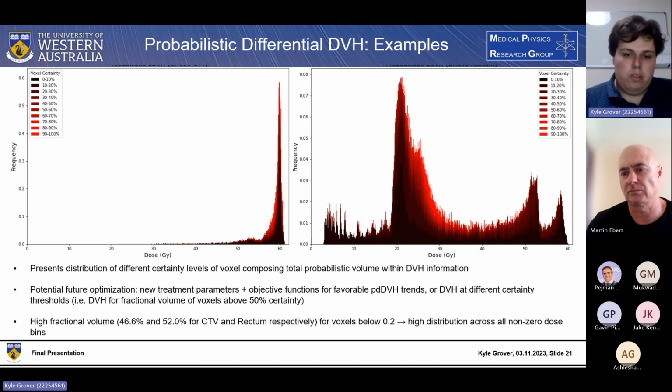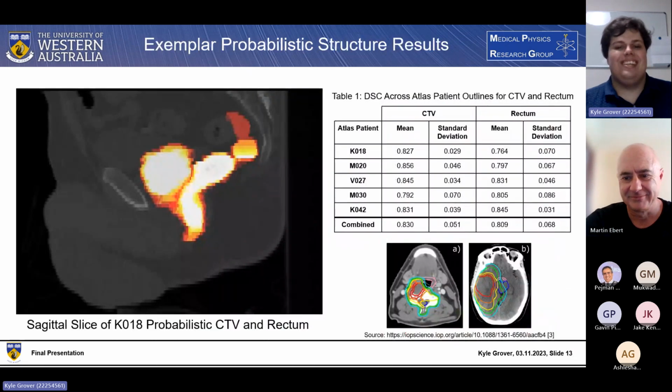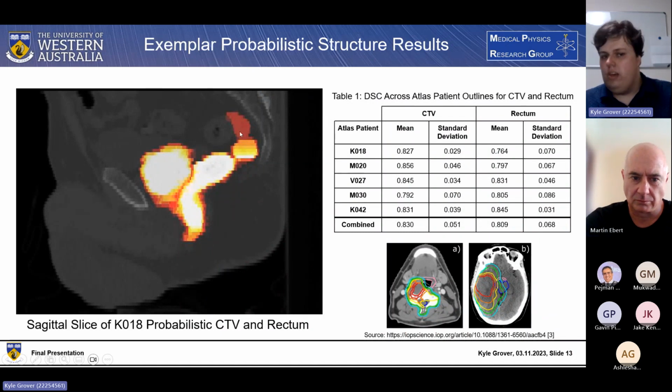Yes, actually. So with the plot that I actually provided, I was specifically including this one just in case I got the chance. As we can see here, especially with this rectum definition, I believe there's only a single observer who defined it so that it extends further up on this slice.